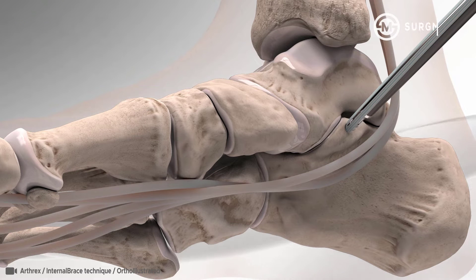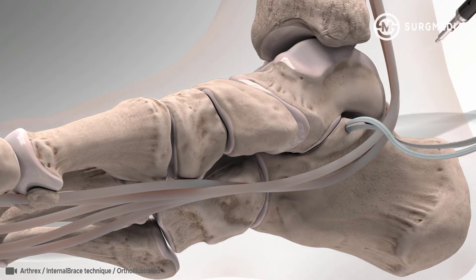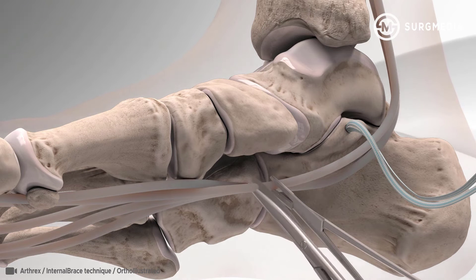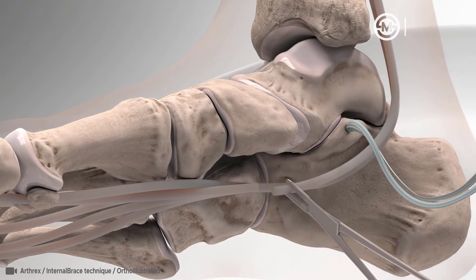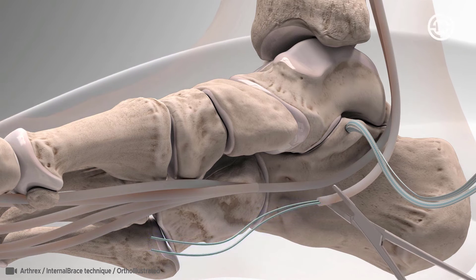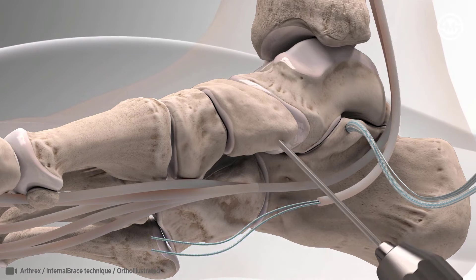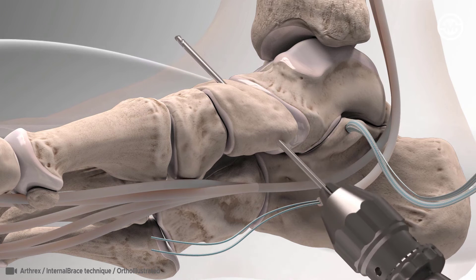The swivel lock anchor is screwed into place. Next, the FDL tendon, also known as flexor digitorum longus, located on the medial side of the leg, is identified, cut, and then tagged with a fiber loop stitching technique. A bone tunnel is then made in the navicular to prepare for an additional swivel lock anchor.